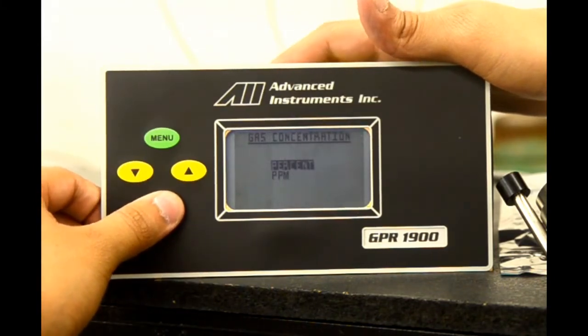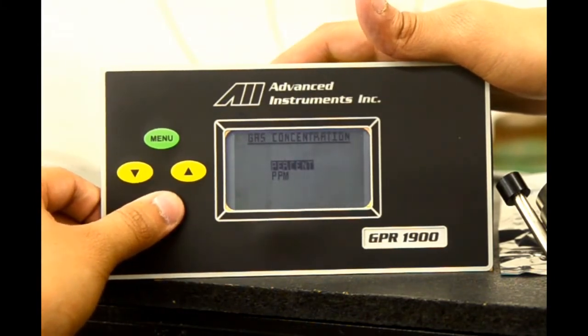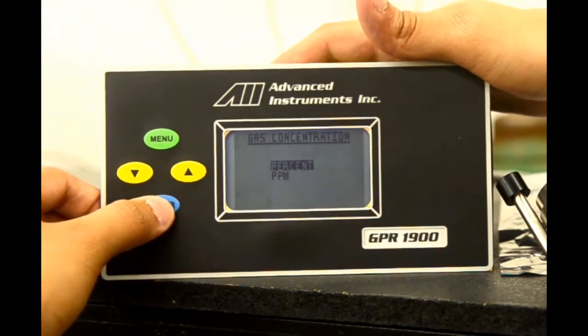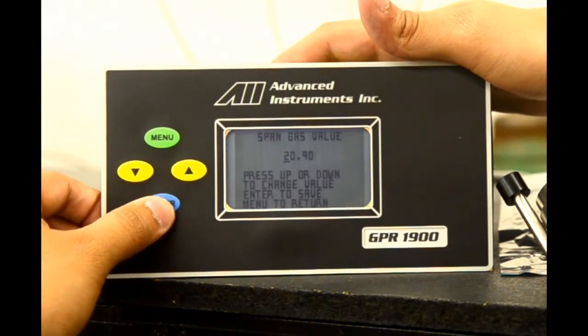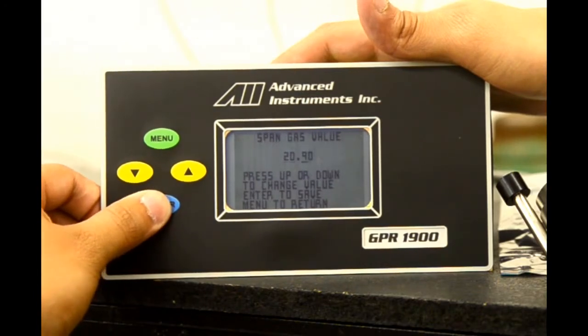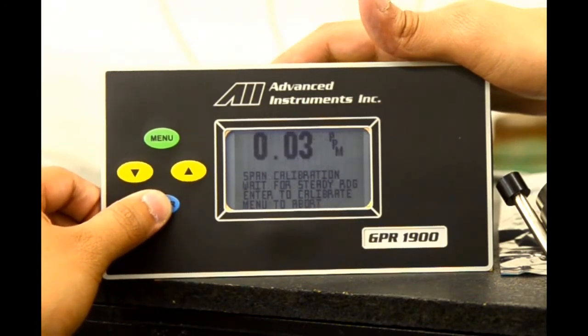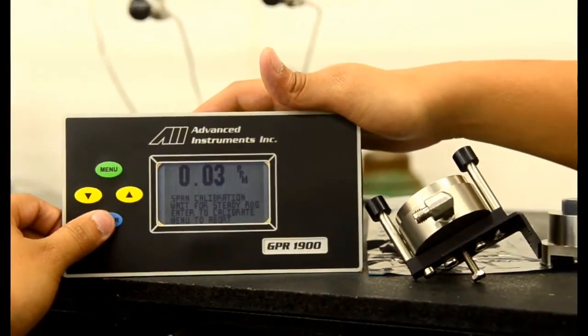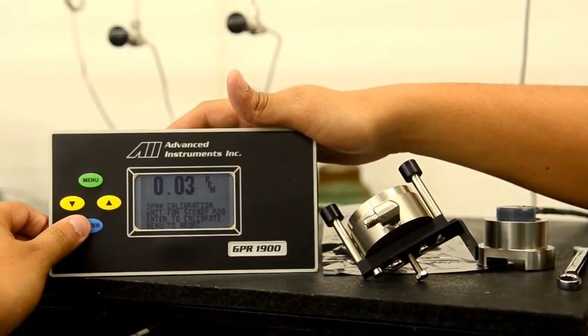We will be performing an air calibration. So we select the percent. But we can easily do a PPM calibration as well. We select enter on percent. And it is preset at 20.9, which is the amount of oxygen present in air. We select enter to scroll through and are taken to the screen that shows a current reading of the analyzer.